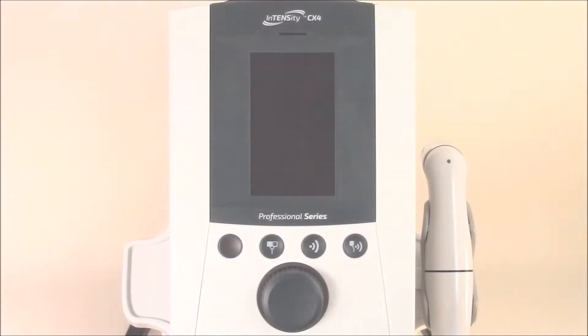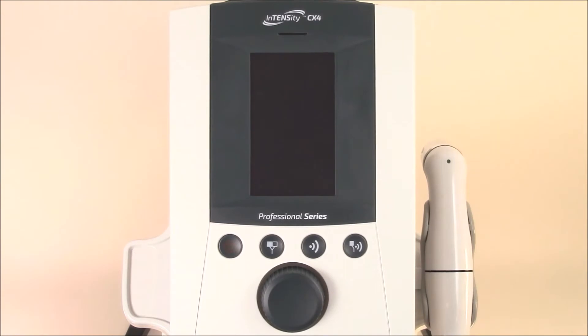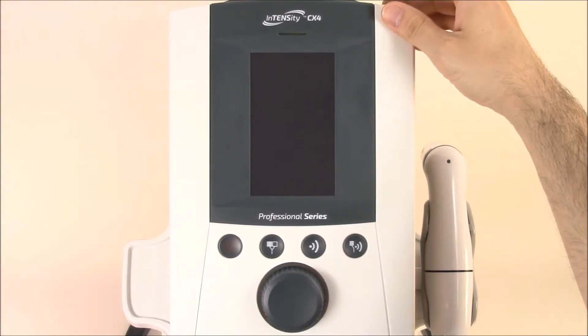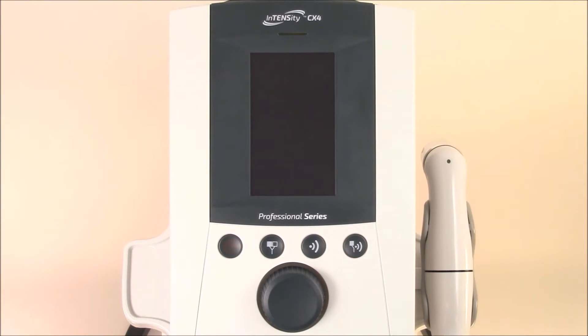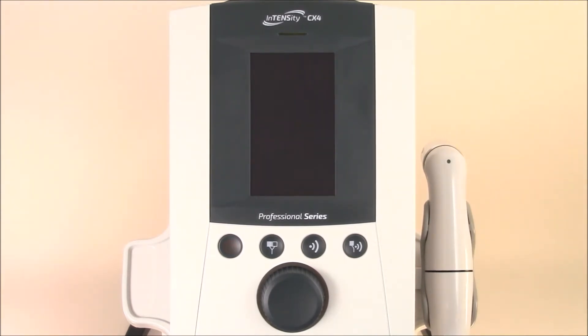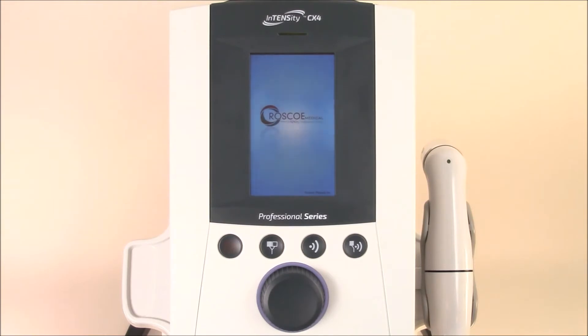Now that we've plugged in the Intensity CX4 and powered it up, we're ready to turn on the machine. Simply hit the power button in the back and you'll hear the device power on. When you hear several beeps, you know the unit is self-calibrated and ready to go.